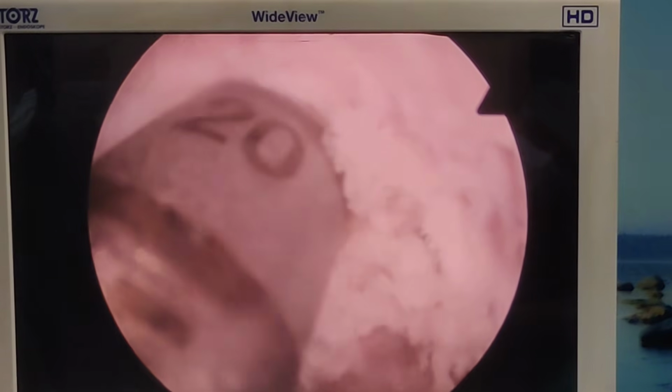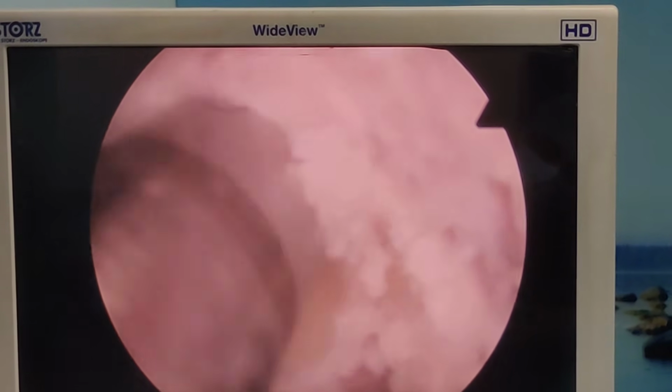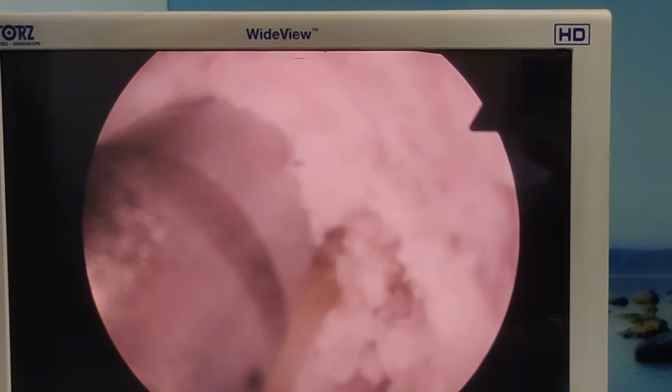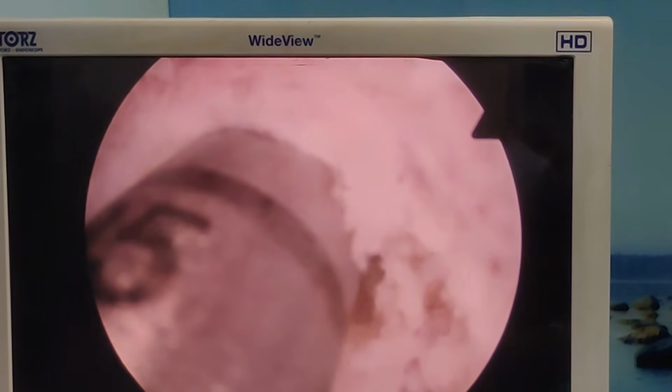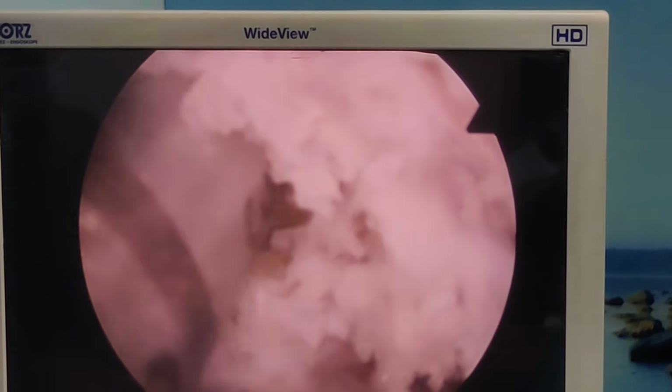So if you're using an Arthrex system, then it's absolutely beautiful. You decide how much you're going to bury, and then it's fine. For us, we have got this fixed end loop button, which is a problem because flipping, if you go a little bit deep, you blow out, and if you go a little bit less, then it's hard to flip. But that is how things work out.